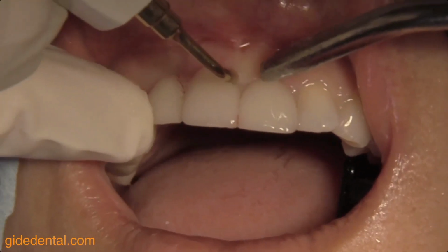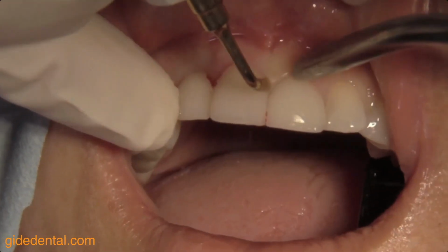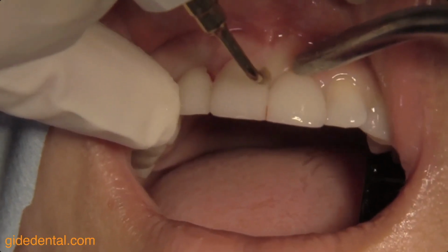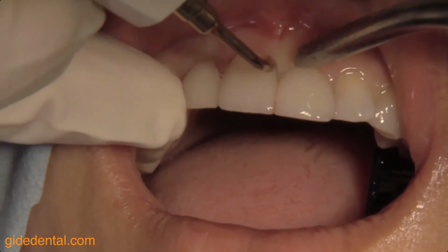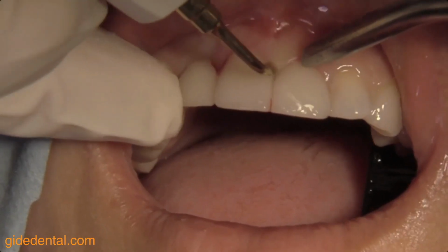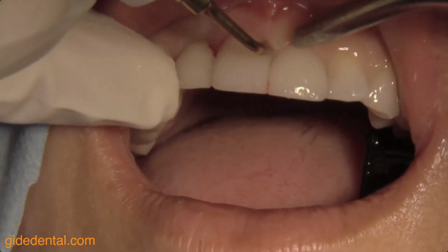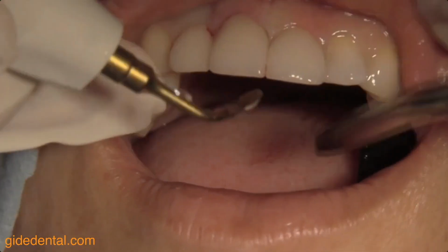Because remember, the buccal bone plate in these anterior teeth can be and usually is very thin. We have this beautiful paper from the University of Bern who showed us that 90% of anterior teeth have a buccal plate which is thin, so less than 1 or 1.5 millimeters, or missing completely. So here's loosening the tooth.